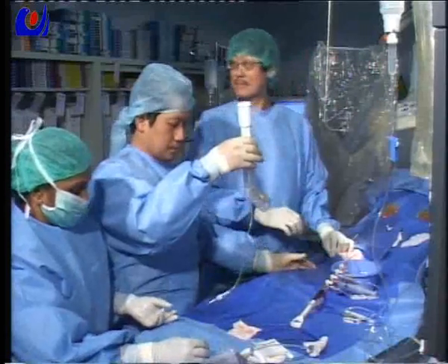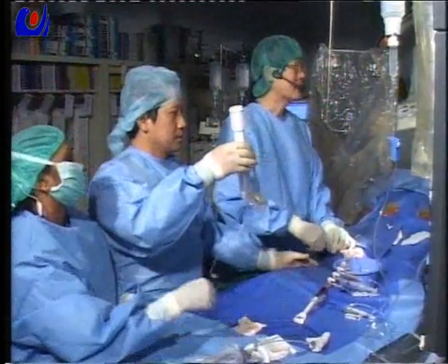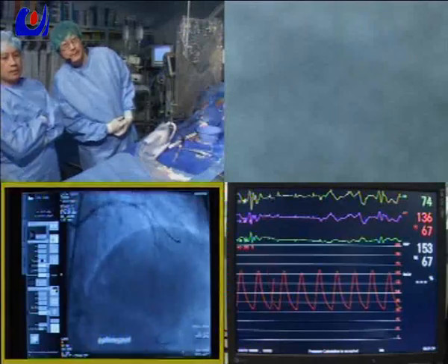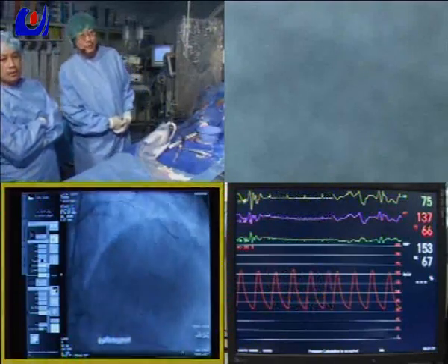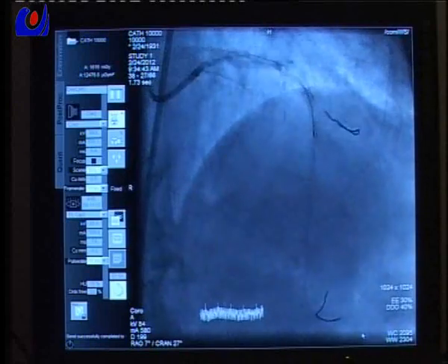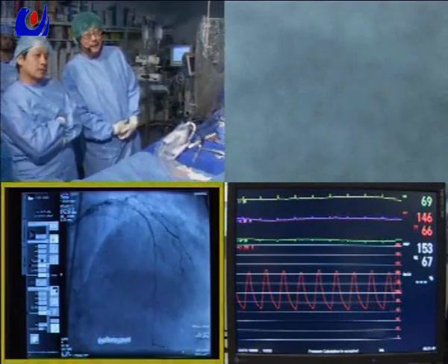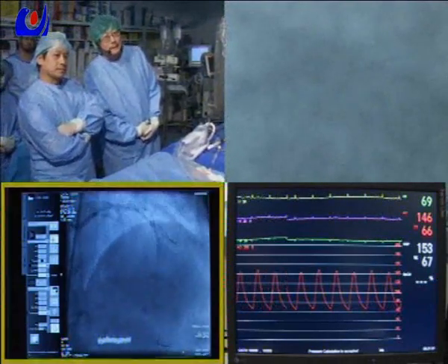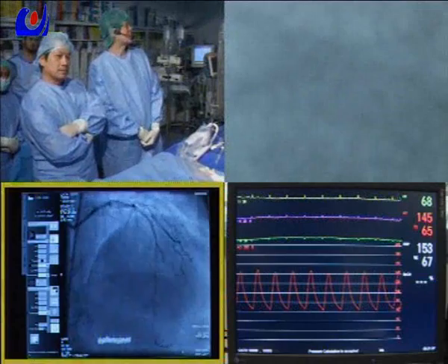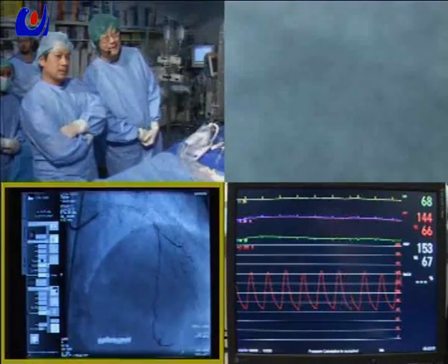So what are you going to do now? I'm going to dilate the proximal more, because I can see on the IVUS, with a bigger balloon. So after we do additional high pressure inflation using a 3.0, we are considering treatment, and the proximal is already better. A 3.0 by 15 NC Sprinter has been chosen for high pressure, and for the proximal we go 16. Then after that we go very high pressure, 20 and 26 for the LAD ostium and left main.